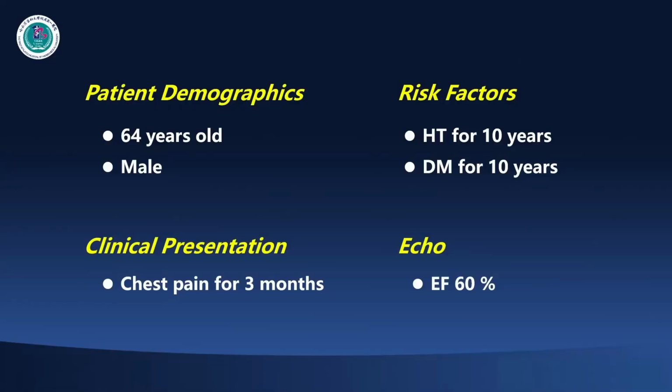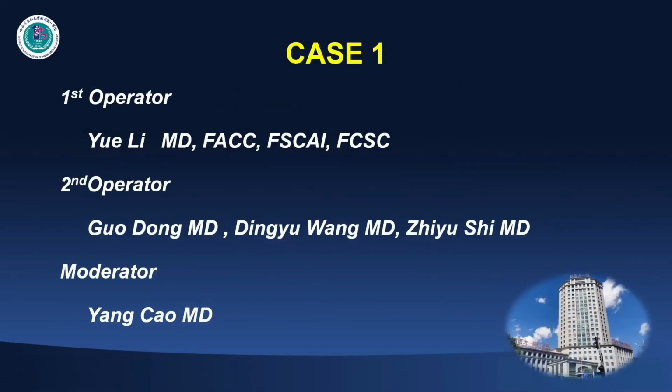Hello, everybody. I'm glad to have this opportunity to introduce this case. First of all, let me introduce the operators. The first operator of this case is Professor Li Yue, and the second operators are Wang Dingyu, Shi Zhiyu, and me. The moderator of this case is Professor Cao Yang.